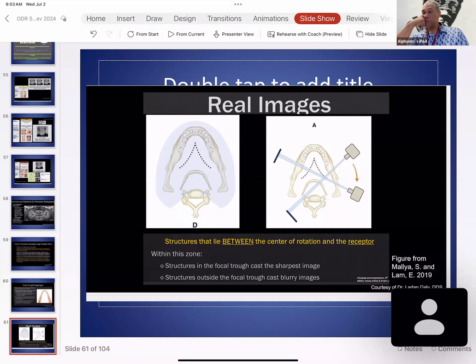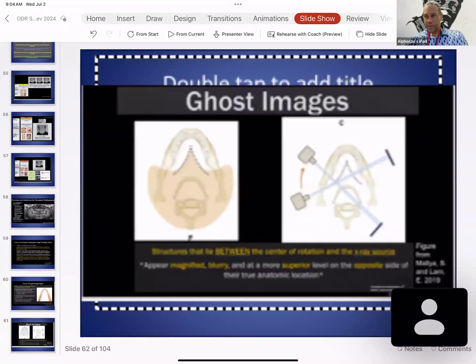These machines have what they call rotation centers, and they'll rotate and pivot. If you see the little dots there, that shows how the unit is actually rotating around the arch and where it will pivot. Just understand that some of these machines have 2 or 3 pivot points. When you're taking the image, you will see the tube head move to a position, and then it'll stop and slide. That's usually where it's adjusting its center of rotation, or pivot point.